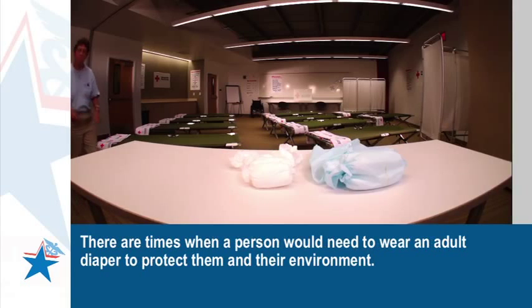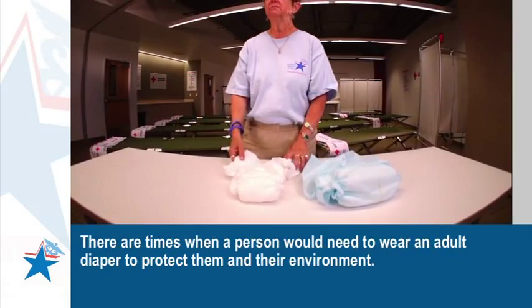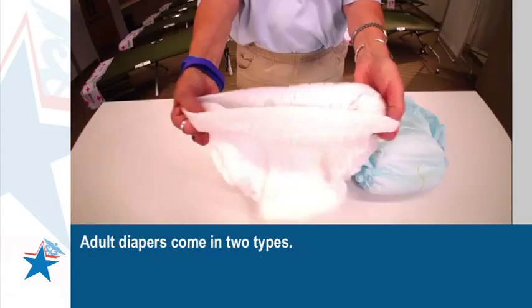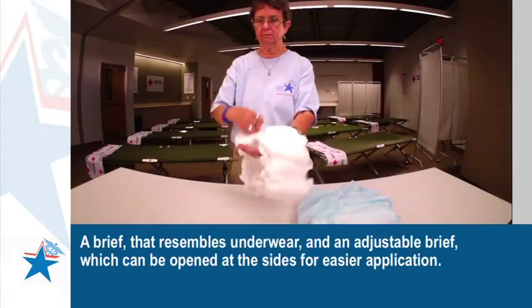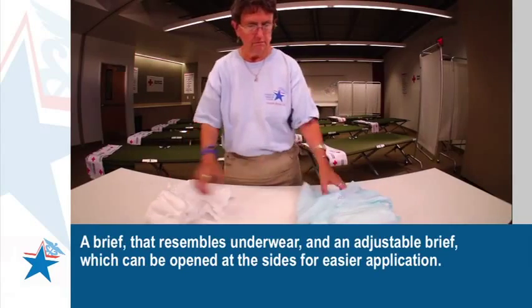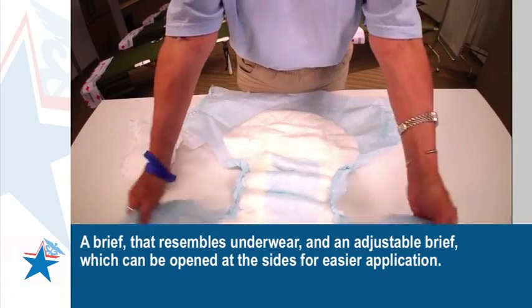There are times when a person would need to wear an adult diaper to protect them and their environment. Adult diapers come in two types: a brief that resembles underwear, and an adjustable brief which can be opened at the sides for easier application.